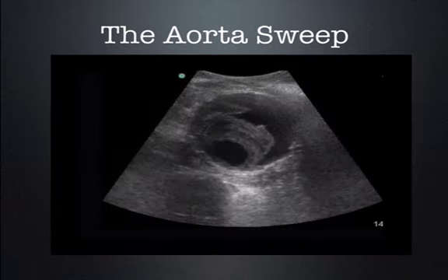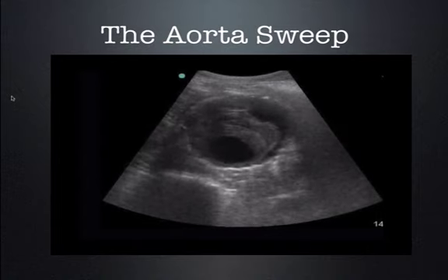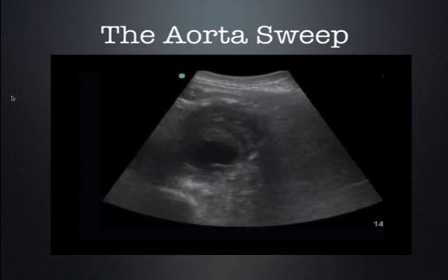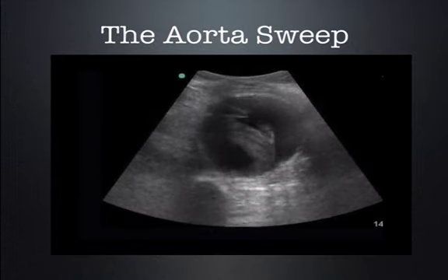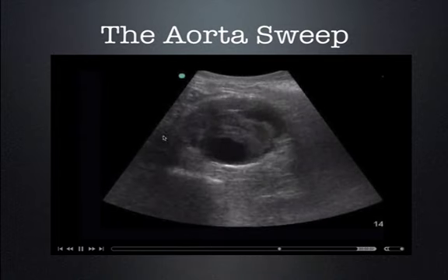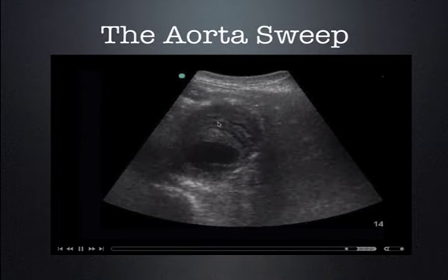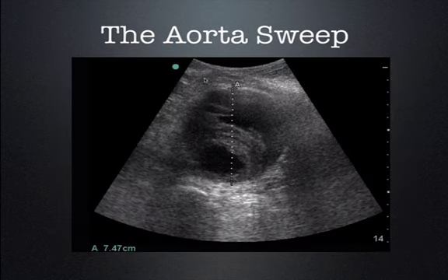Now, if on the other hand you see this, this is an abdominal aortic aneurysm. In a hypotensive, unstable patient for whom your gestalt is high for ruptured AAA, this is AAA. You assume it's ruptured. We don't see any free fluid, we don't care about that. This is in all likelihood a ruptured AAA. You call vascular surgery. This here is showing how to measure an AAA.